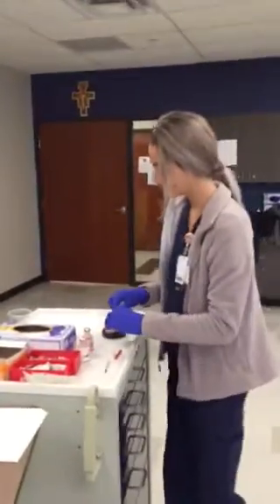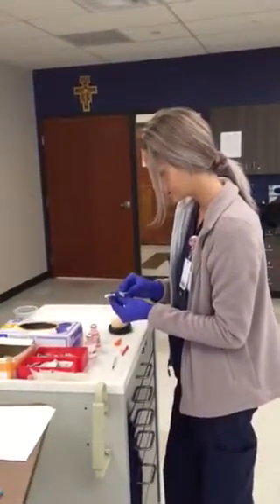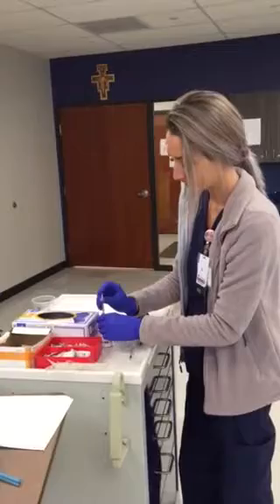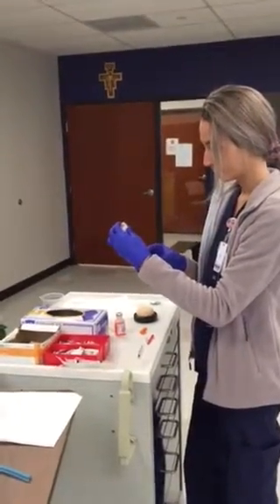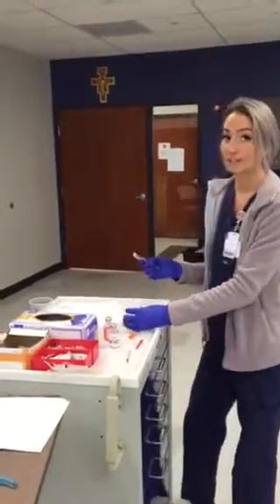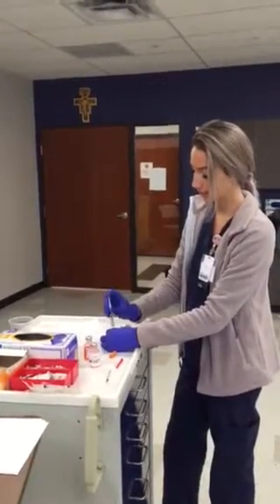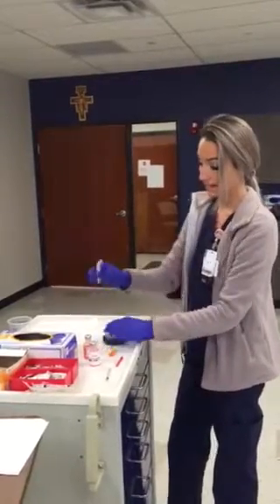So again, I'm going to clear this first for what she needs, so 1,500 units. Injecting air in. I've alcohol swabbed her stomach, injecting air in, and then I'm going to go 1,500. Again, alcohol swabbing. Now here I'm pinching an inch of her, since it's sub-Q, it's the fatty part of the skin. So I'm pinching in, and again, I'm still injecting it like a dart. It's going straight in and coming out nice and slow, wiping it down.